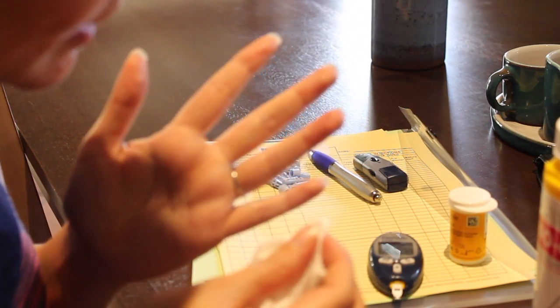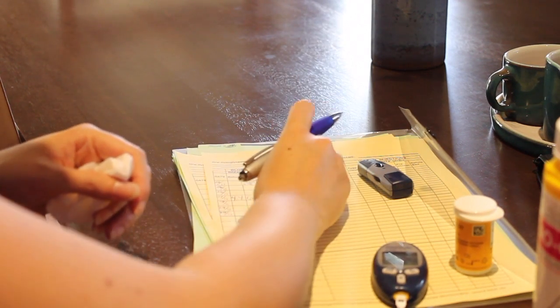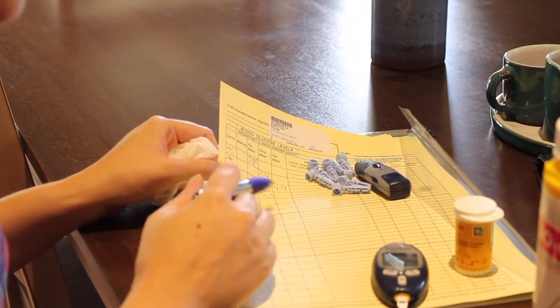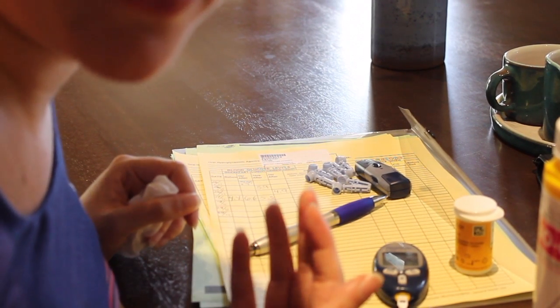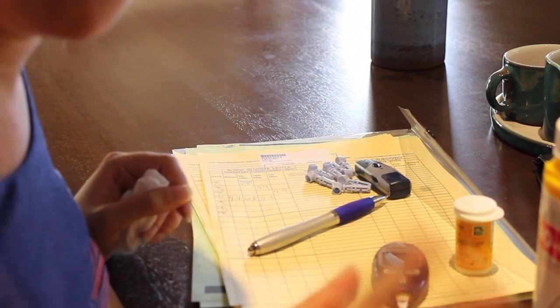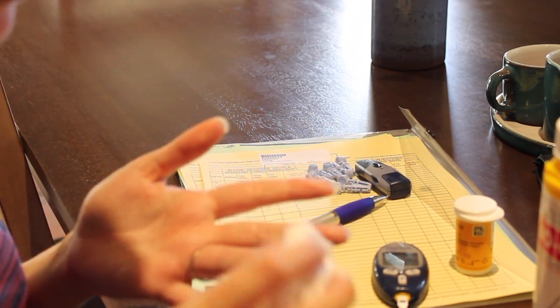Okay, so that is fine now, all mopped up. So now I make sure to note my results one hour after lunch, 5.5, which is actually 1.1 less than after breakfast. But for breakfast I had waffles with a bit of maple syrup, so it makes sense that it would be a bit higher, but still well below the healthy limit. We're rocking this, and you can too, I'm telling you.